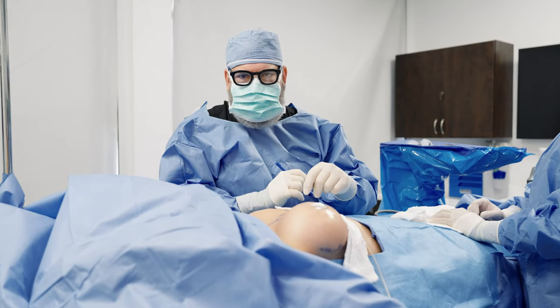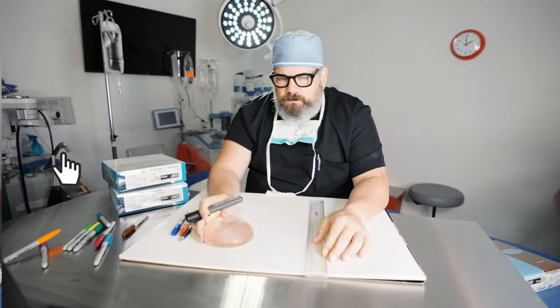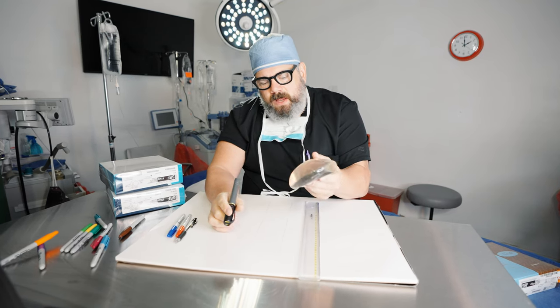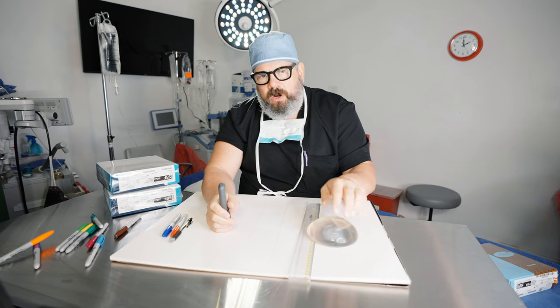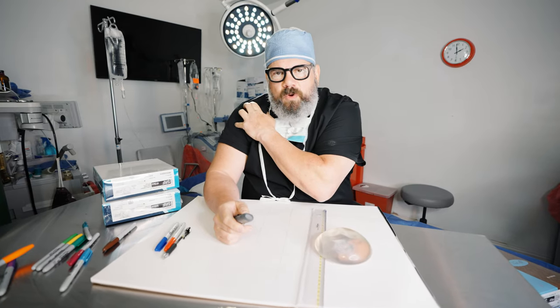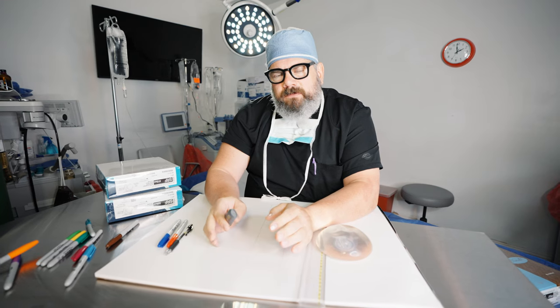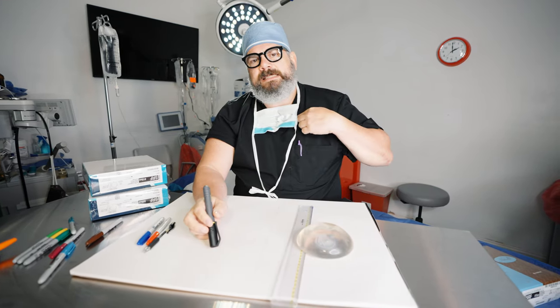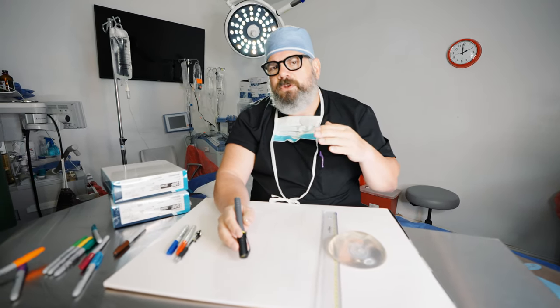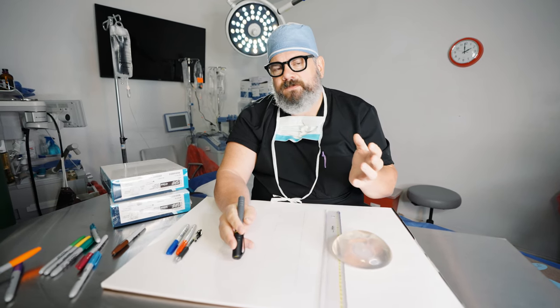After finishing this breast augmentation, we're going to talk about the profile of implants. Patients are coming in talking about wanting a high profile or sometimes they don't want a high profile. They're concerned, but all of it focuses on this area of the chest. I think people have a misunderstanding of what a high profile is, or just what a profile is for an implant.